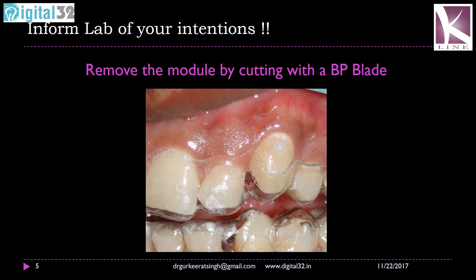All you need to do is use a number 11 or 12 BP blade — a sharp blade — to cut the module, and you will have a very nice-looking, very rounded composite button. You don't need to do any removal of excess composite because it is bonded onto the tooth, and you have a perfectly formed button available to you.